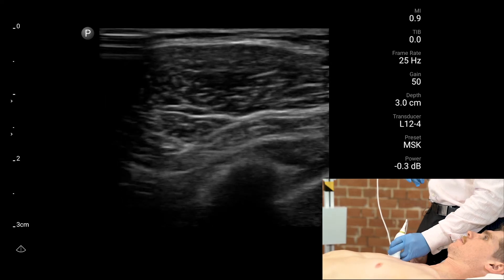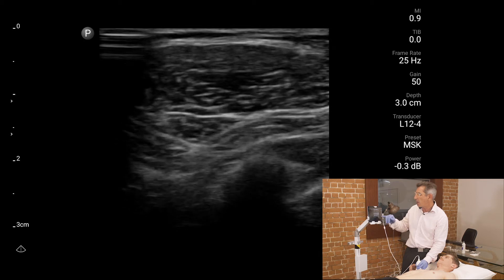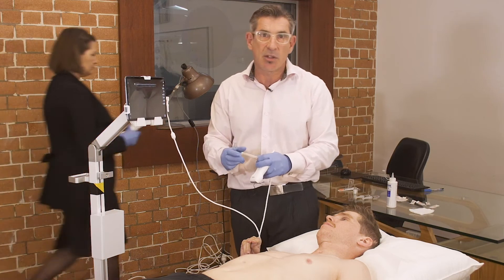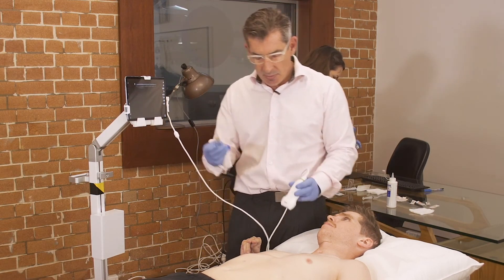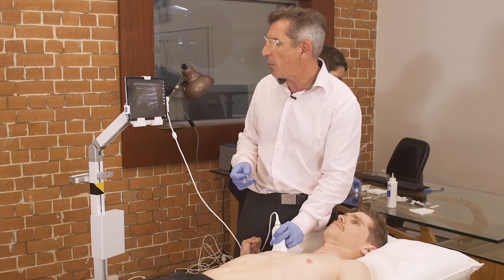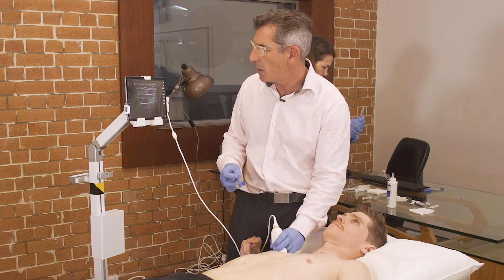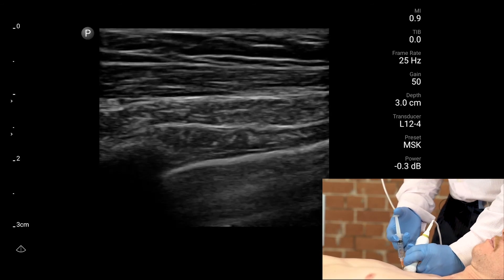So if I inject with a needle that is two centimetres in length, I will avoid hitting any underlying structures such as his lung. With this dilution of 20 units per mil, and I want to put 40 units into his pectoralis major, I need to give him two mils. Scratch now.